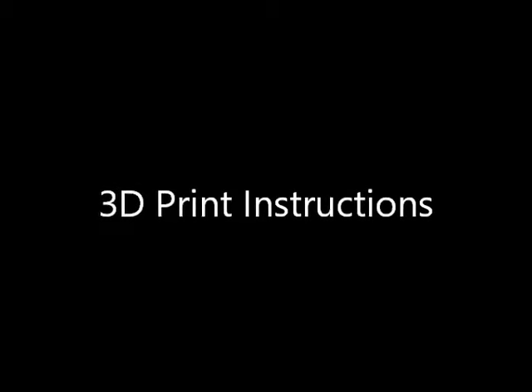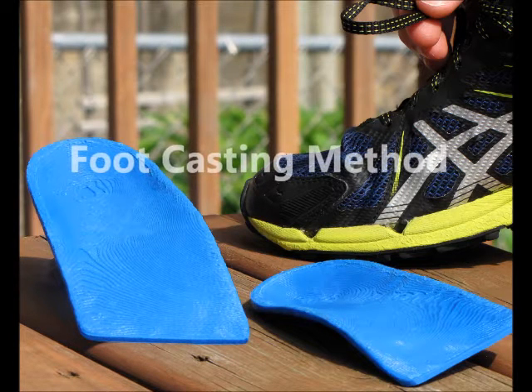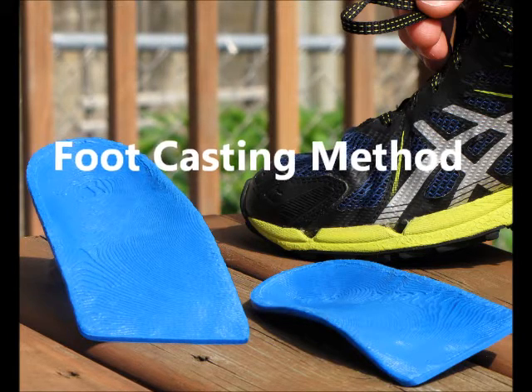Here it is — a quick and easy to follow method for casting your arch. This step is super important, but if you follow these simple steps you can get a great cast for making a great set of 3D printed orthotics.